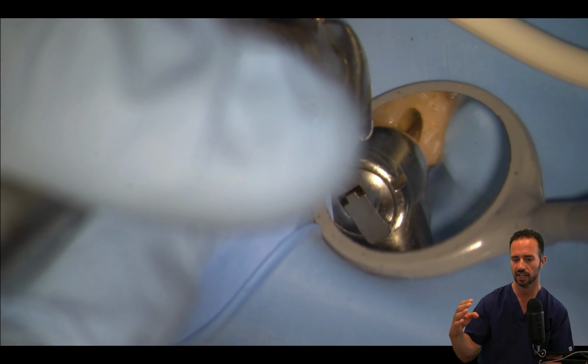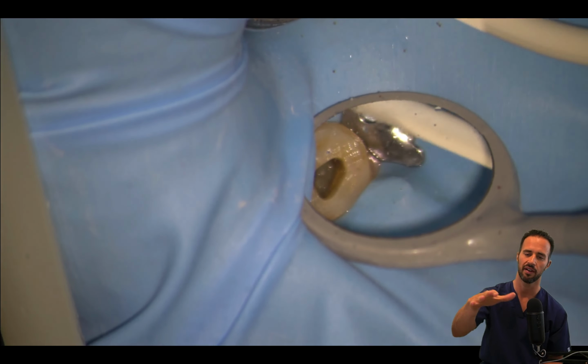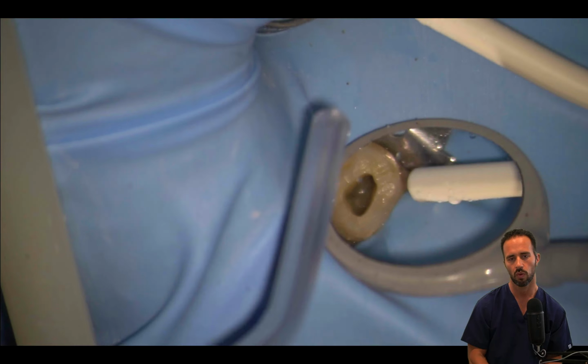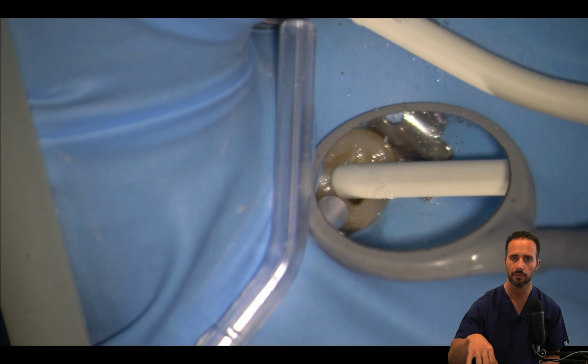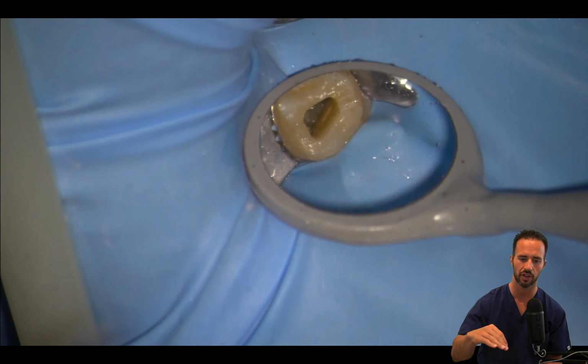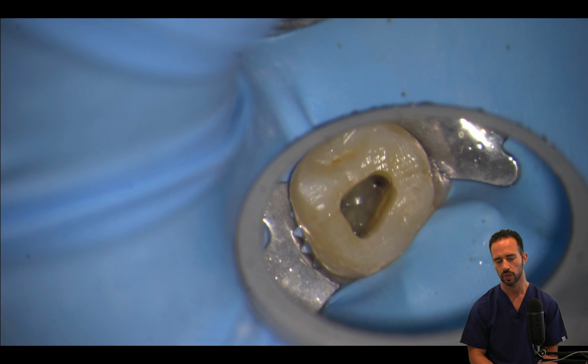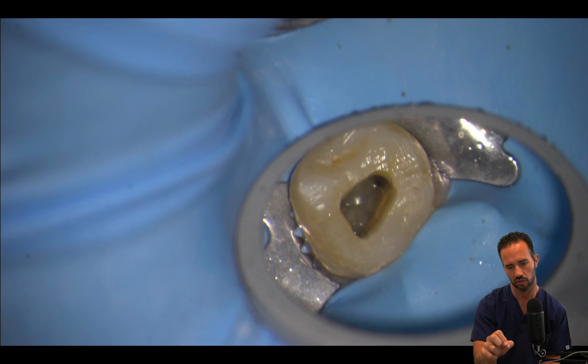And so oftentimes in the area where the MB2 is, you have a layer of dentin that's covering it. So you want to take either your Endo-Z bur or your chamfer diamond and remove some of that dentin that's oftentimes covering where the MB2 is. And now under high magnification, we can see very clearly the floor of the pulp chamber. And remember, the floor of the pulp chamber has a map. You see those dark little lines that go from the canal orifice and trace the map, or the outline, of where the canals are.